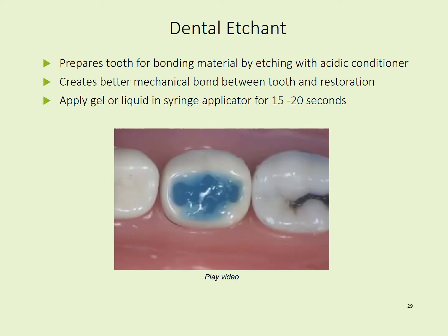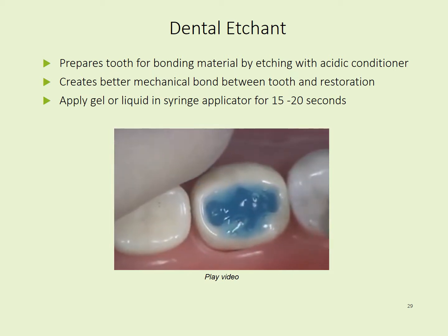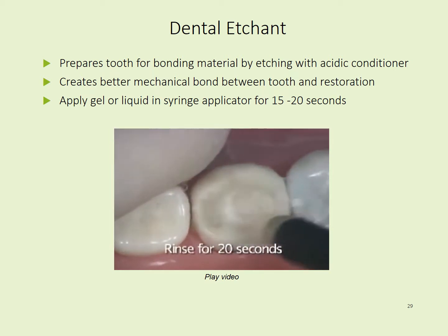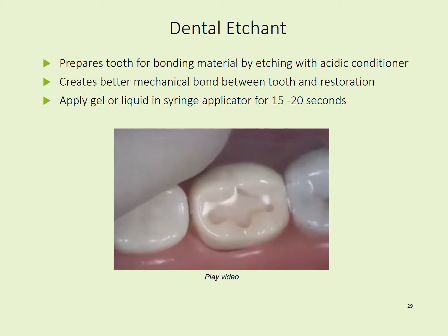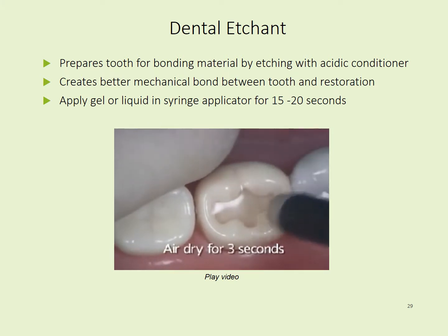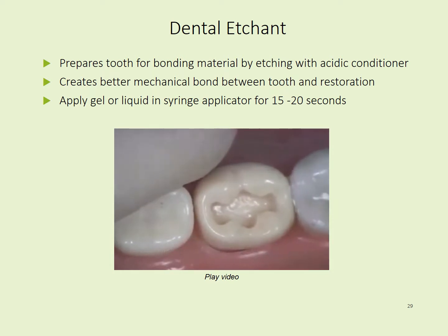Notice that I've applied the etchant beyond my cavity surface margin, and you want to do that to make sure that your bonding agent is going to bond to an area that the acid etchant has been in contact with. You want to leave the acid for 15 seconds, and then you want to rinse for 20 seconds. You want to then air dry for 3 seconds and leave the surface slightly moist.